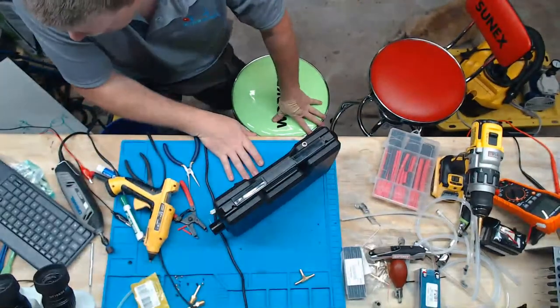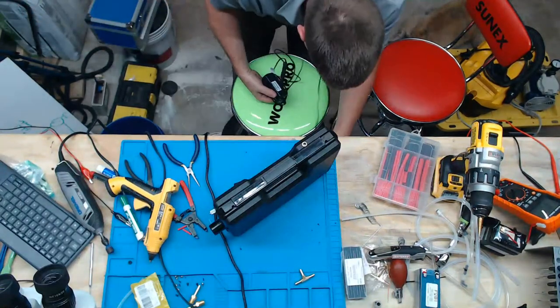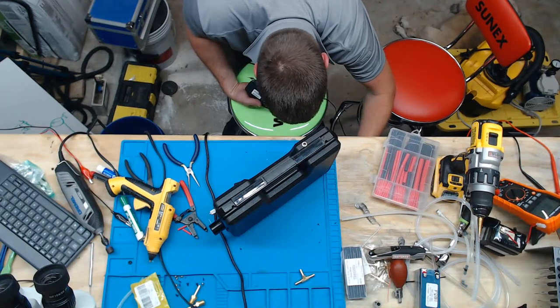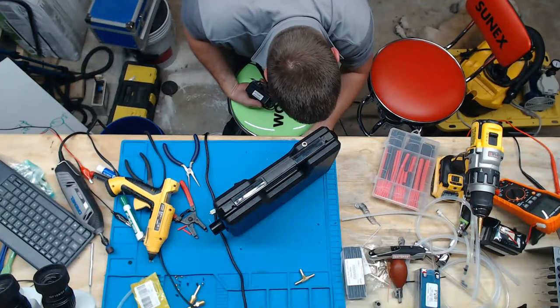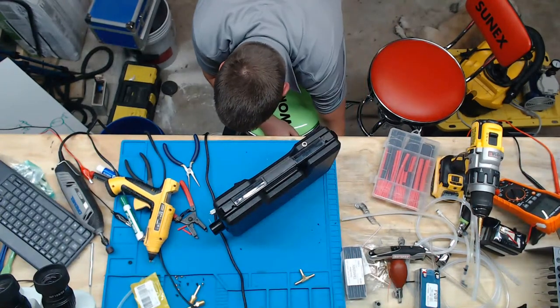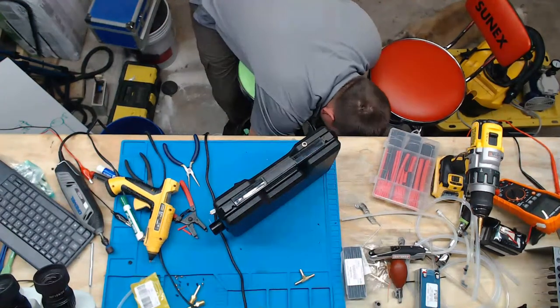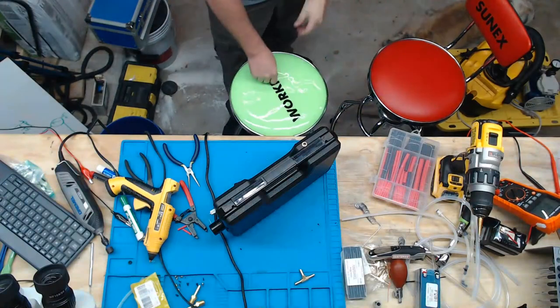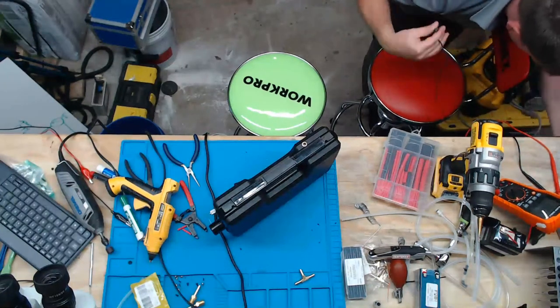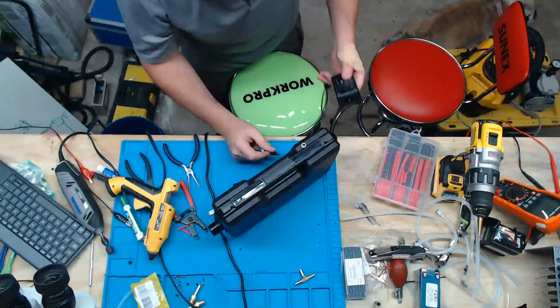So let me get a power barrel connector. I should have one or two of them floating around here. I have a whole drawer full of parts right here. You never know when you're going to need them, man. What's this? All right, I'm gonna have to go over to my power supply drawer. Or do I? Is this it? So close.